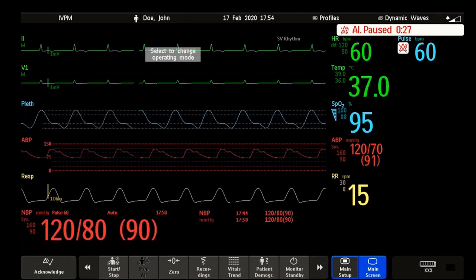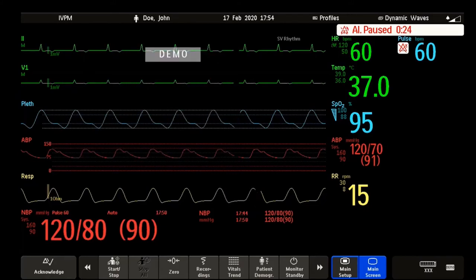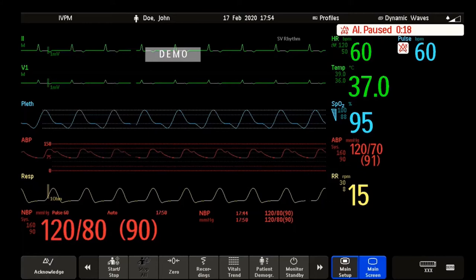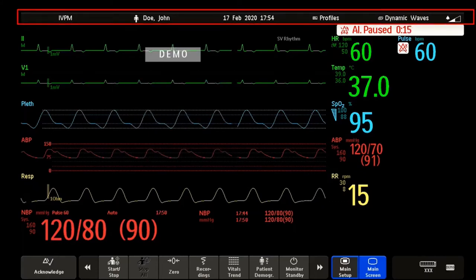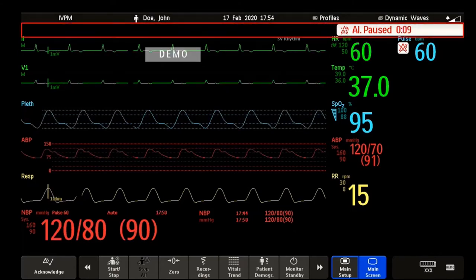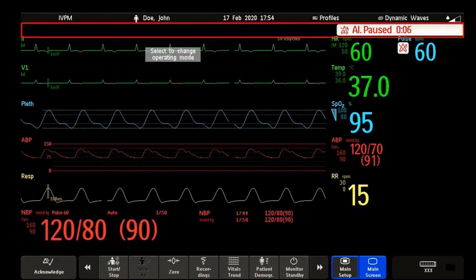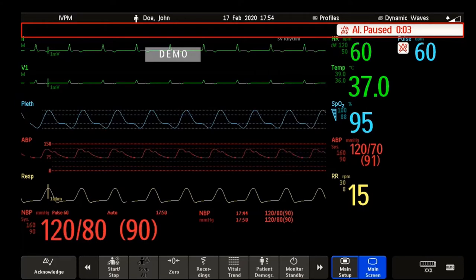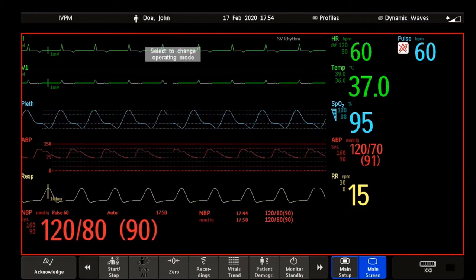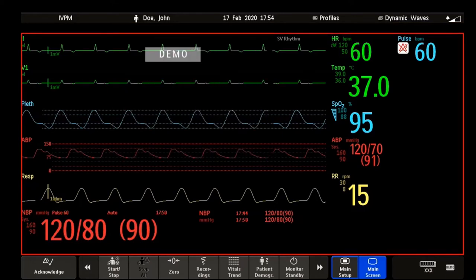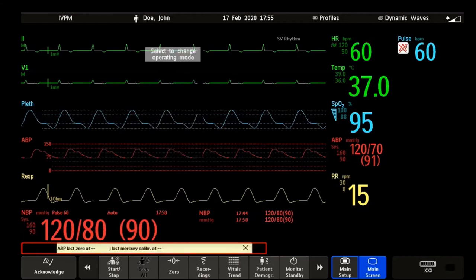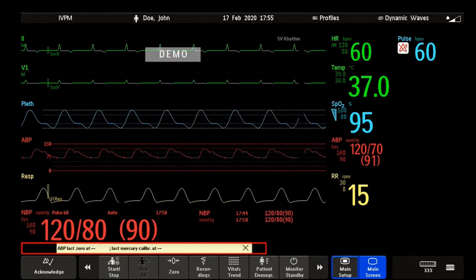You are viewing a screen of an Intelliview Patient Monitor displaying data in demo mode. The screen is made up of different areas. This is the monitor information line, displaying amongst other things the patient name. The alarm status area shows active alarm messages or alarms-off symbols when all alarms are switched off. The measurement area displays the clinical measurement values, the waveforms, the trends, and the clinical applications. The status line shows messages with information and prompts you for possible actions.